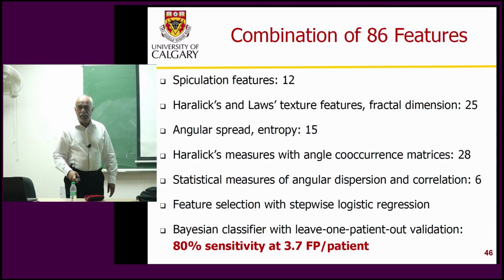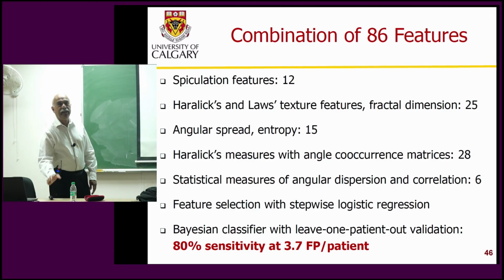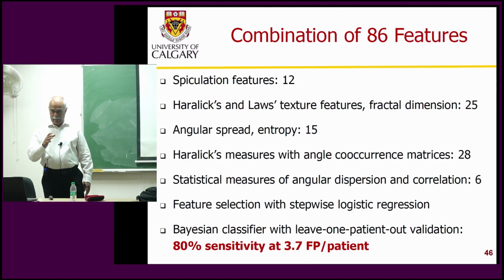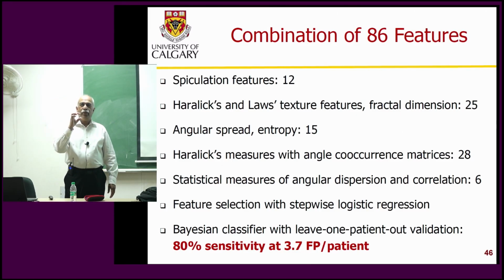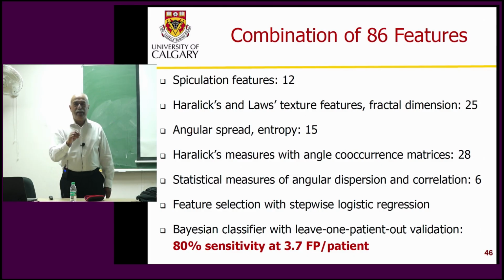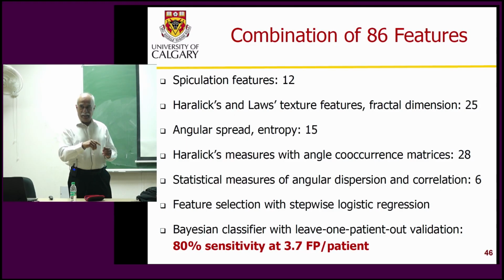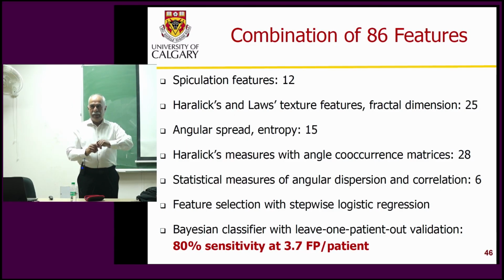Now, Jayashree also did another project where we said there should be some agreement of angle also in a small window of analysis. So just like you do gray level co-occurrence matrix using Haralick's statistical measures, we said we will do angle co-occurrence. So we asked the question, if the angle at this point is this, what are the angles of the neighboring pixels using Gabor output?